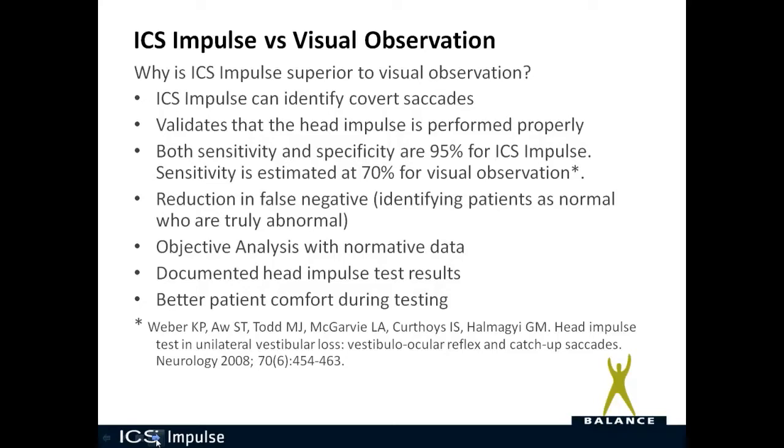Objective analysis with normative data. It's documented head impulse test results. So you have documentation that the test was done and this was the results instead of just a handwritten note, which you would have with visual observation.